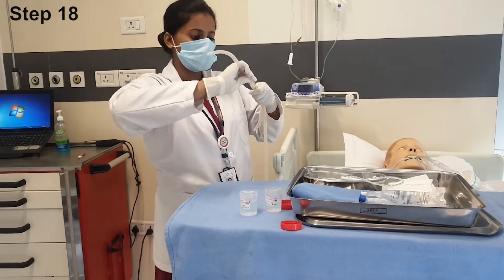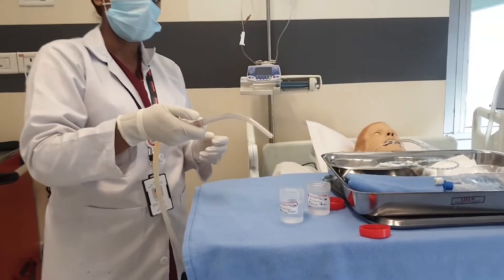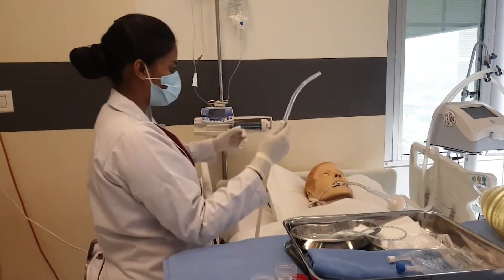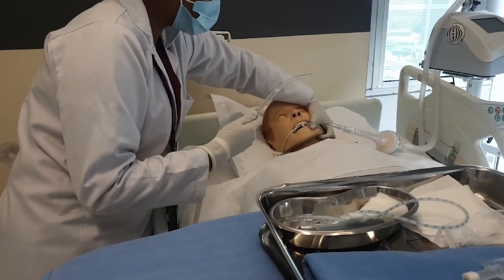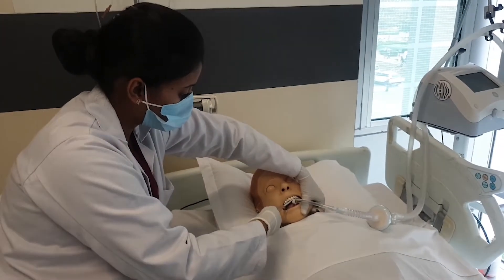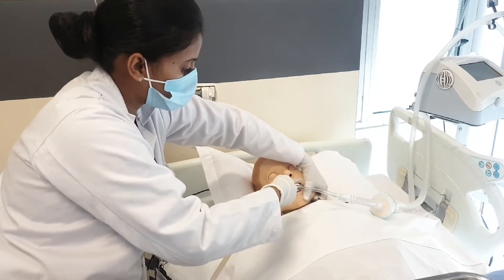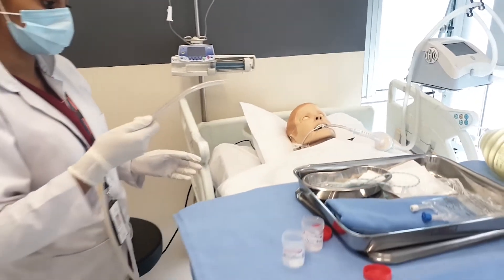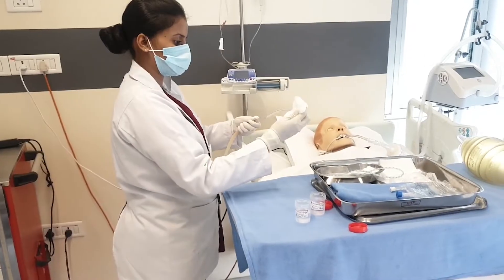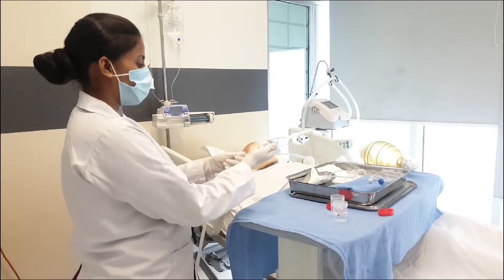Attach the Yankauer tonsil tip catheter for oral suction and pre-flush it with normal saline. Turn the head of the patient to your side. Open the mouth and perform oral suctioning for 10–15 seconds. Clean the Yankauer tonsil tip catheter with gauze and post-flush it, then detach the Yankauer tonsil tip.